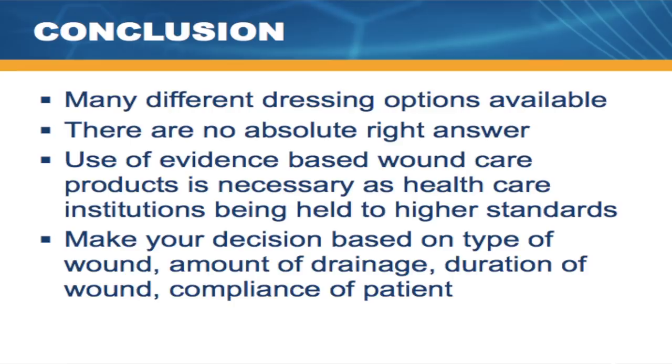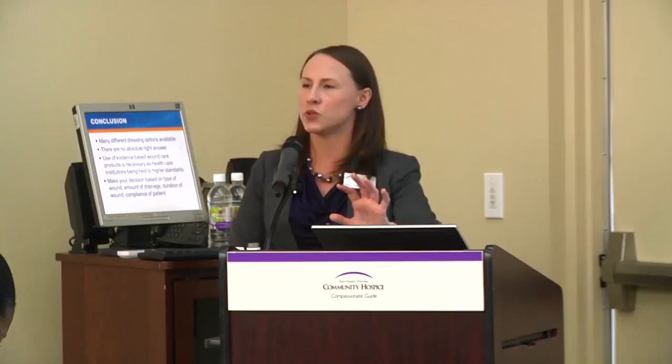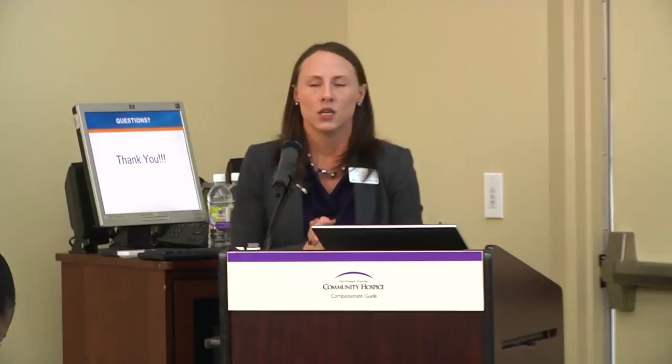And making your decisions not just based on the type of wound, of course you need to be treating the wound and treating that whole patient and having it managed medically, but treating the characteristics of that wound. If it needs debridement, debride. If it needs bacterial management, use an antimicrobial. If it needs a moist wound healing environment, you can use a very simple moist wound healing dressing, and you may be able to achieve the results that you're looking for. So, that concludes my portion.